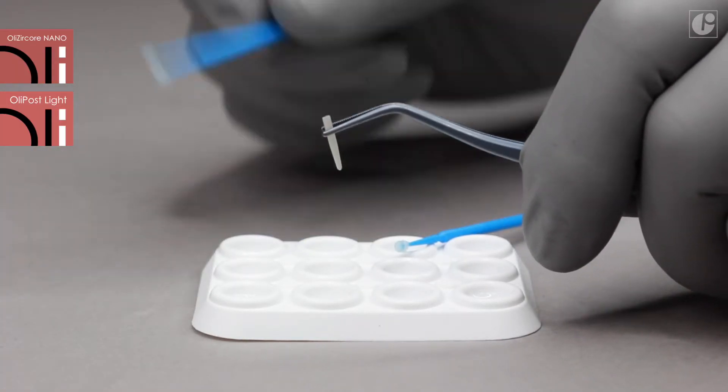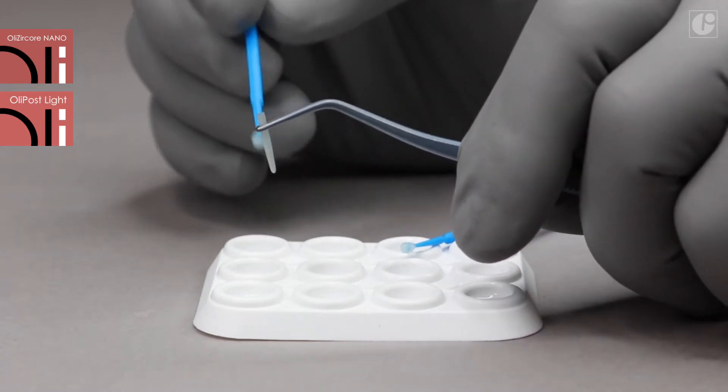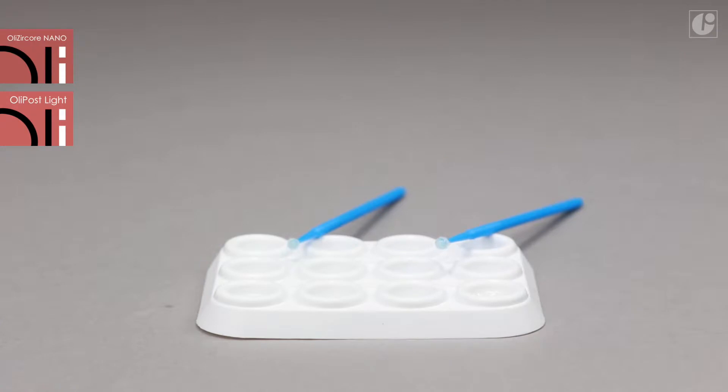OliPost Light posts are pre-silanized; however, in order to keep the highest quality of the procedure, it is recommended to degrease them with alcohol and apply fresh silane. Composite cement adhesion to the post will be improved substantially.